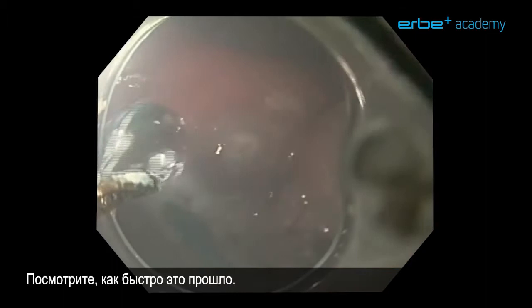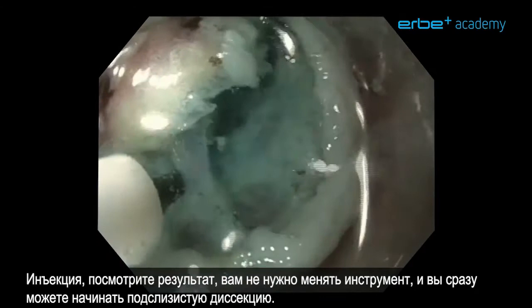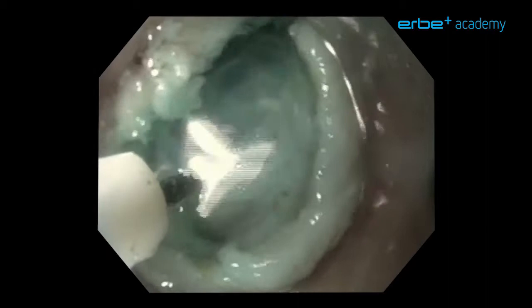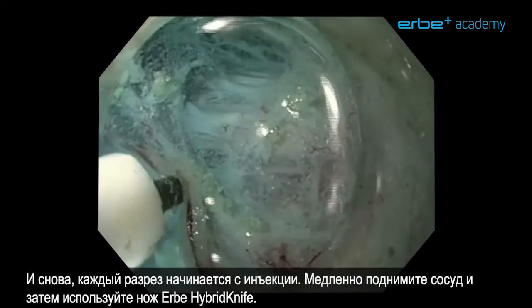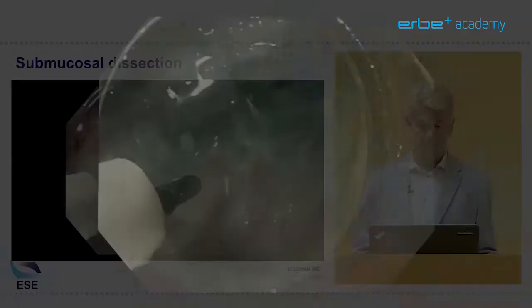Look how fast that went. Submucosal dissection is exactly the same — next to a vessel, inject, see what happens. You don't need to exchange instruments and can immediately start your submucosal dissection. We have a good view of the muscle layer so we should be able not to cut it. Every cut starts with an injection. Slowly lift this vessel and then treat it using the Erbe HybridKnife — just like that.